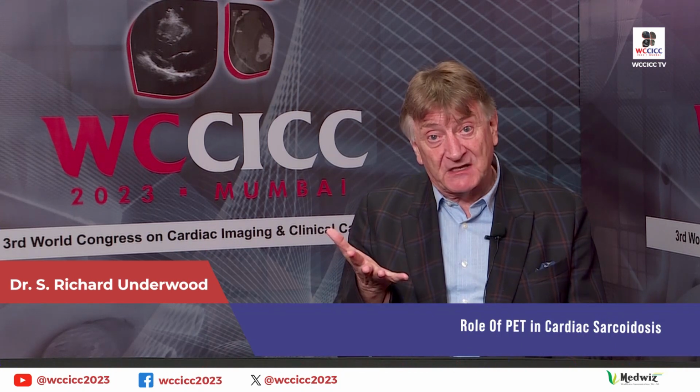I would say, though, that again it may be rather insensitive for small, rapidly moving structures such as a metallic lead in the heart. But nonetheless, it is something that's worth doing, particularly maybe for the intravascular leads behind the sternum, maybe in the subclavian vein, where it's difficult to see those by other techniques such as echocardiography.